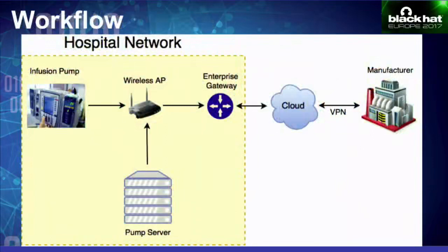Again, I've tried to create a workflow. The infusion pump was connected to the hospital infrastructure using wireless. It constantly spoke with the pump server. The pump server stores and caters configuration to an infusion pump: your patient name, the drug for that patient, how much dosage, at what time, and so on and so forth. Manufacturers usually have access to these devices through the hospitals' VPN, so they can connect remotely and troubleshoot. Like I mentioned, most of these devices are heavily maintained by manufacturers' own technicians and not by the hospital staff.